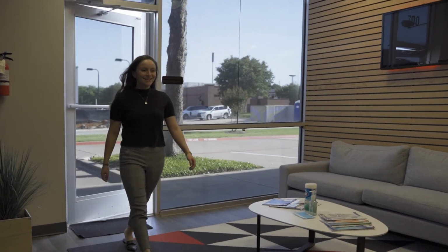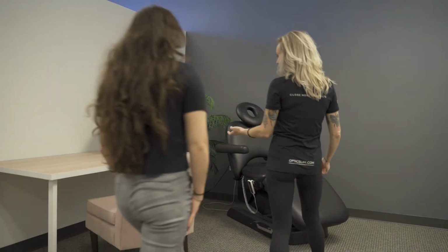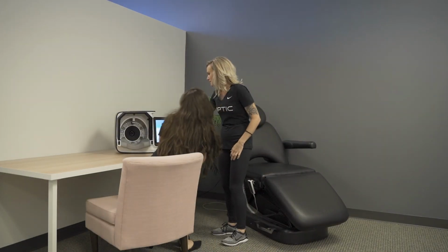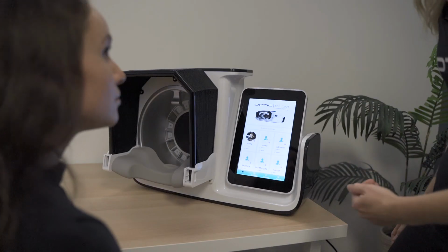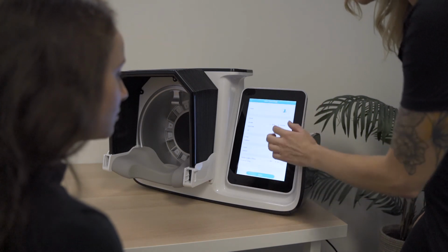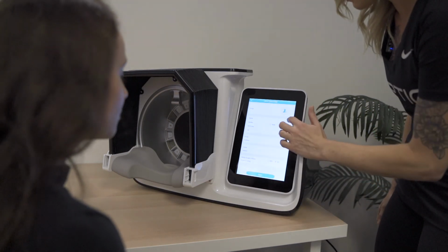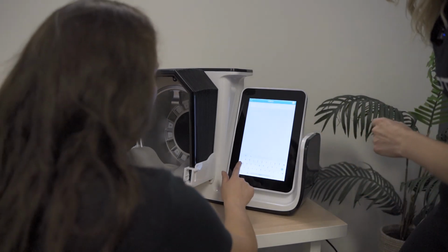Hey, Abigail, nice to see you again. Come on in. Have a seat. We're gonna scan you into the Optic. We're gonna take a couple pictures with the Optic of your skin to see what's going on. We're gonna get a profile started for you. We're just gonna need a couple pieces of information. So first, if you can go ahead and put your name in there.